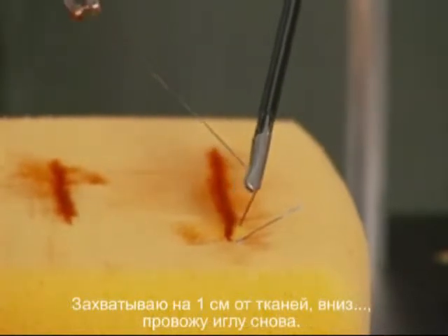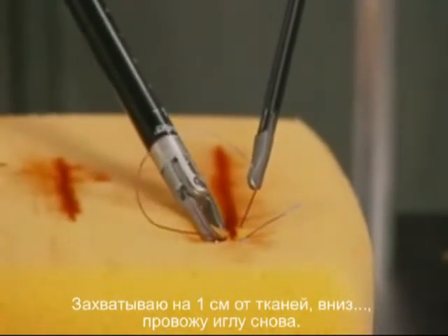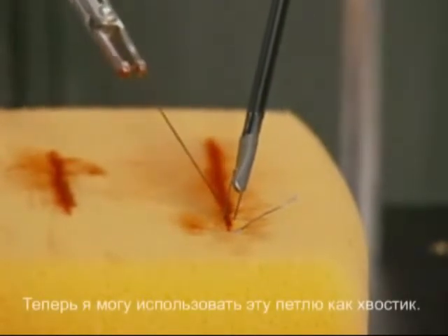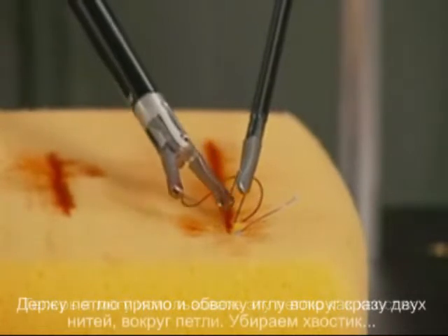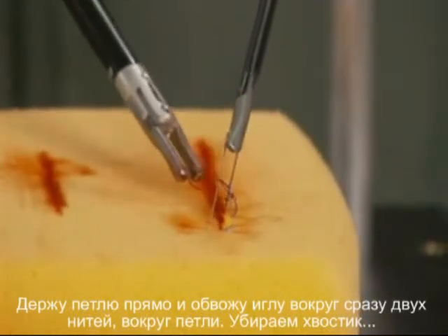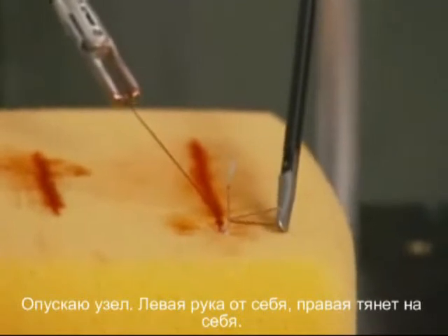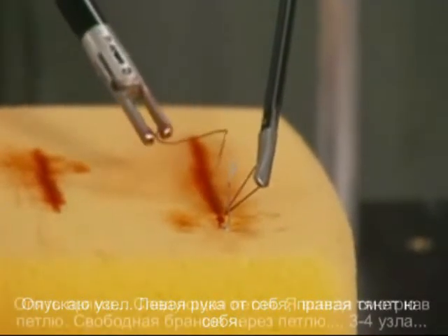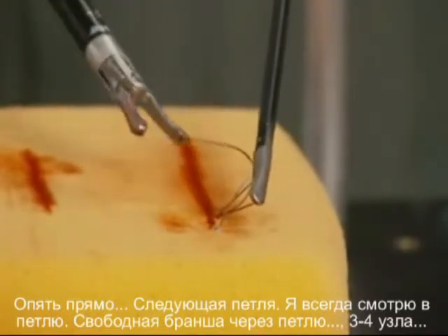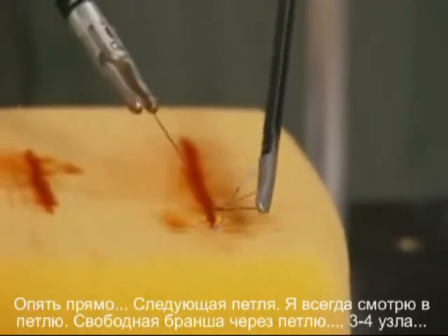I'm just going to finish by tying to a loop here. I'm going to grab my suture about a centimeter from the base, come down and pass the needle again. Now I'm going to use this loop as a post and keep that straight up, then pass my needle around both sutures. Just use the free arm to get it out of the way — pushing with my left and pulling with the right. The post comes straight up again. Always looking for that loop and putting the free arm inside the loop. A good three or four knots should do it.